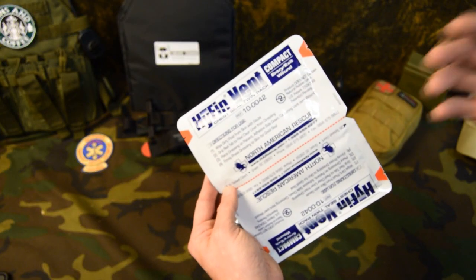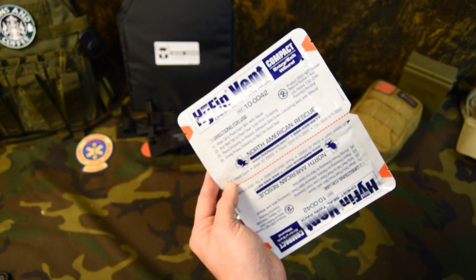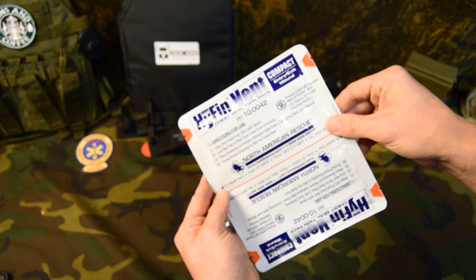Hey, welcome to another video from Skinny Medic. I wanted to give you another product review here. This is the compact version of the Hyfin Chest Seal made by North American Rescue.